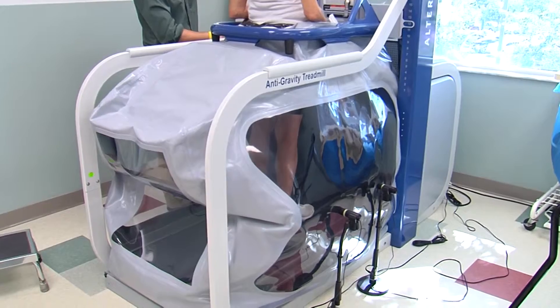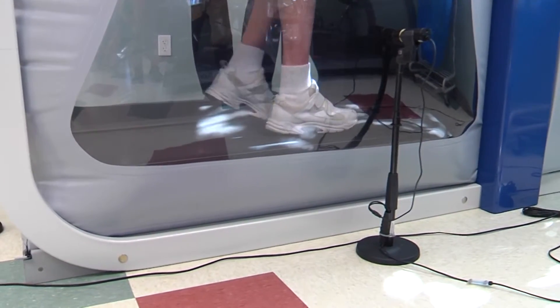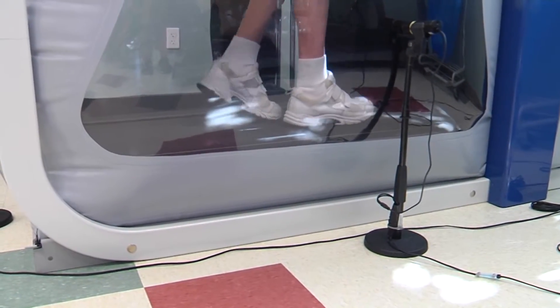I've been able to put a lot of different patients in it — from stroke patients to running patients to pain patients — and everybody I've put in it has benefited from it tremendously. Bringing space age technology down to earth. For Lee Memorial Health System, I'm Amy Osher.